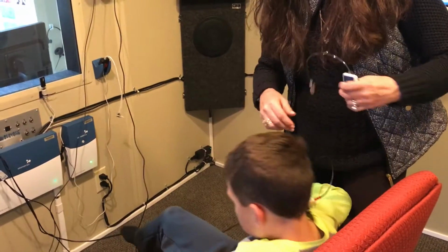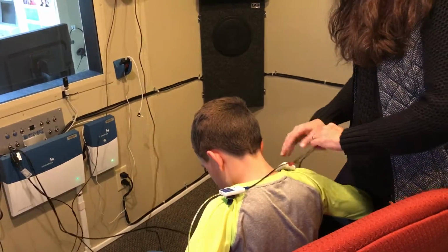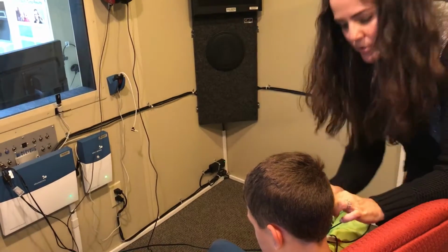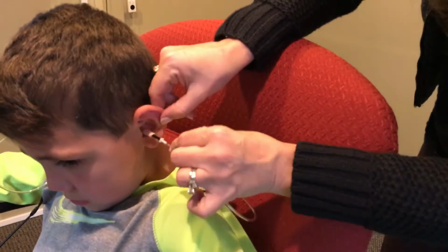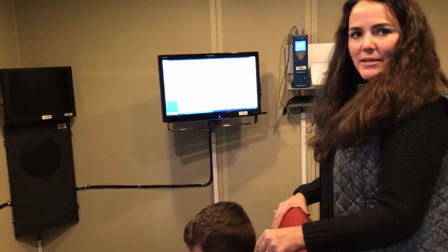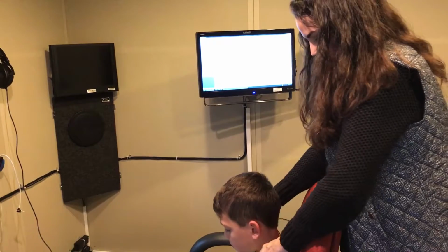Sit up tall for me. Red is right, blue is left. We squeeze the earpiece, or just sort of press it together in your fingers, and then put it all the way in the patient's ear. We use inserts instead of headphones because it fits deeper in the ear. It also lets us test without having to mask as much. And you'll learn about masking later on in this chapter. I'm going to take the inserts out.